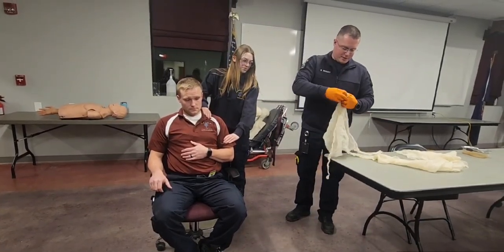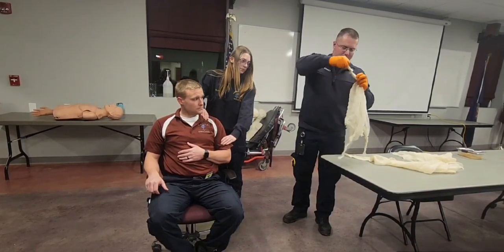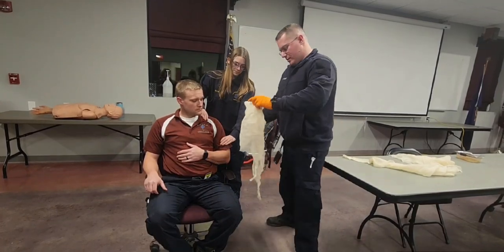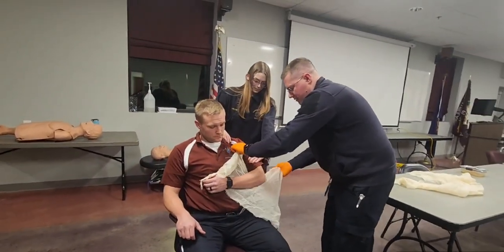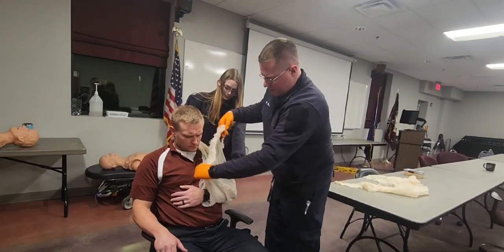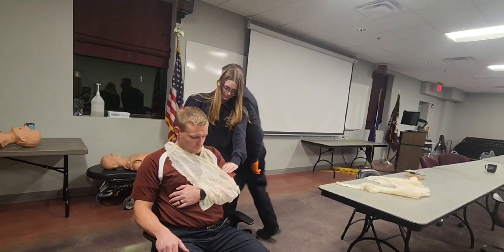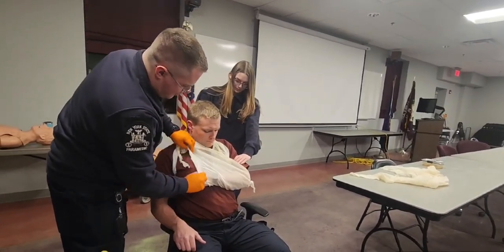I'm going to select triangular bandages for the splinting. I'm going to tie a knot in one of the ends — that is going to be my capture point. I'm going to slip this under the patient and make sure that the knot is in the elbow. I'm going to remember to bring the front of the triangular bandage across the other side of the body and take out all the slack.